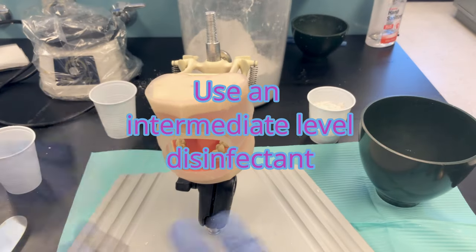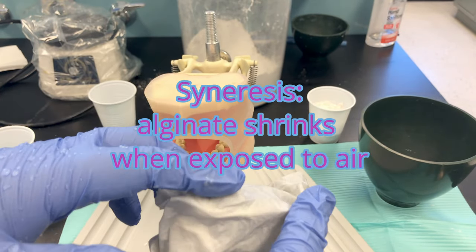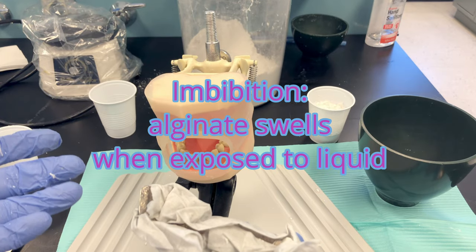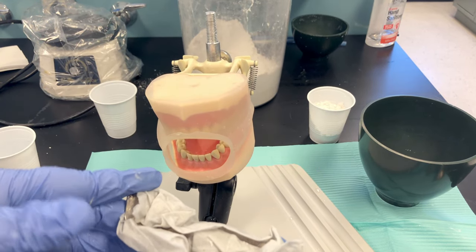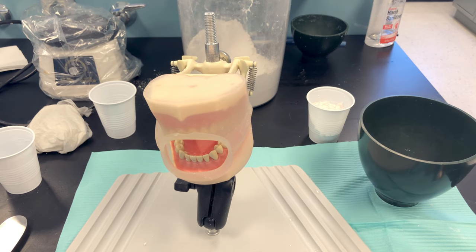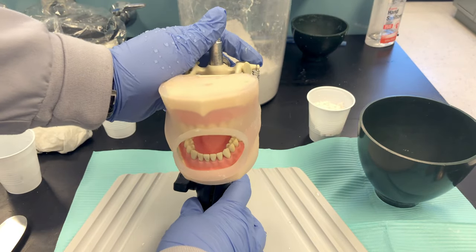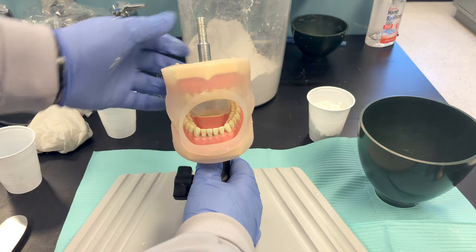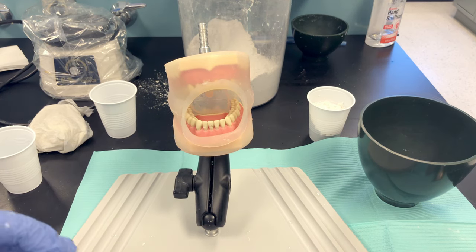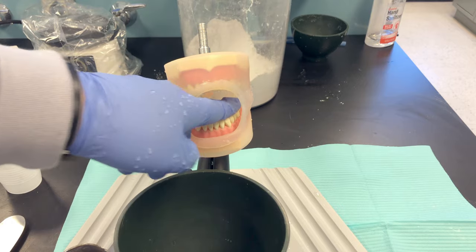Once you rinse and disinfect your impression, wrap it in a moist paper towel — alginate is moisture sensitive and needs to be poured within 15 minutes. By the time you finish the other impression and dismiss your patient, head to the lab. Chroma Clone is shelf stable for five days if stored in a 100% humid environment — a humidor or a plastic bag with a damp paper towel that isn't touching the impression. Seal it and you can pour within five days.